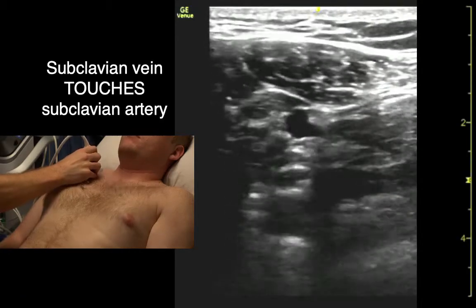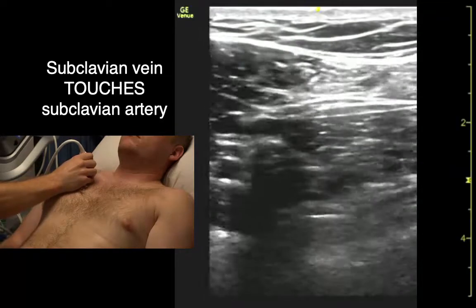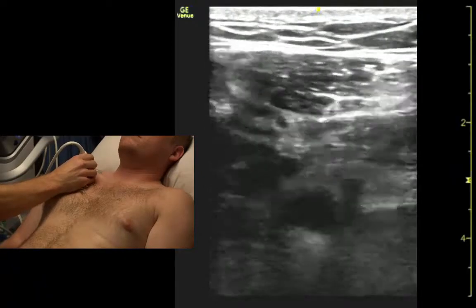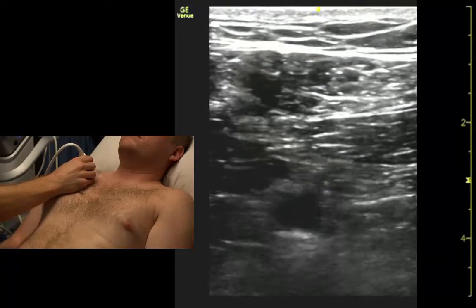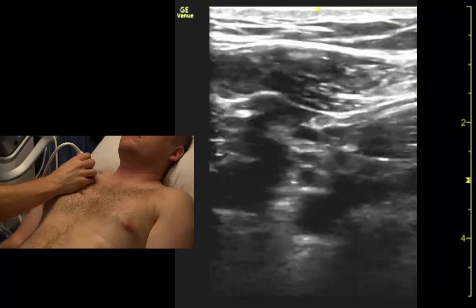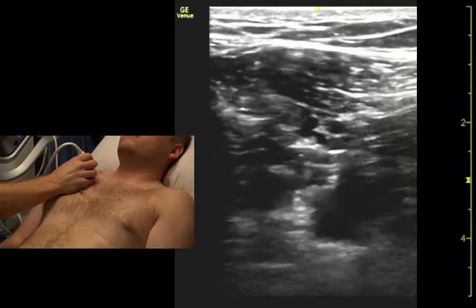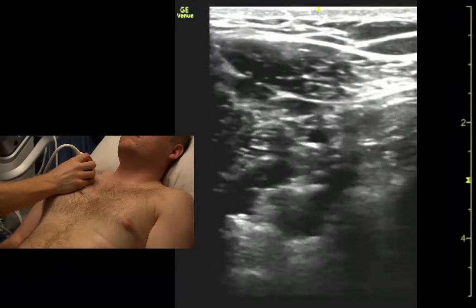And now relax, and we can even compress it a little bit. That's it down there next to the artery. If it's spontaneously collapsed, there's no clot in it. And if we're not sure, we can lie them back.